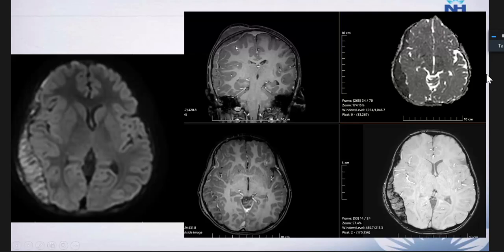They were not restricted to one of the bones. They were showing multiple bone involvement. So that was indicating that it was looking like more of a diffuse metastatic spread rather than just a primary bone tumor affecting only one area.